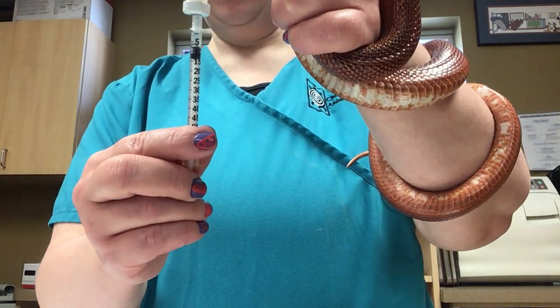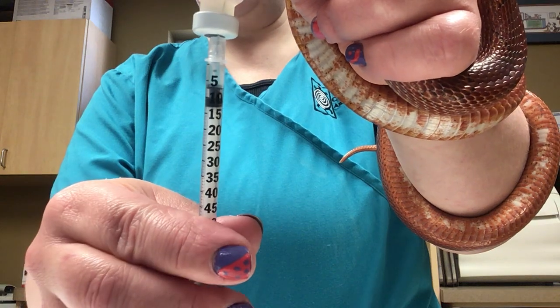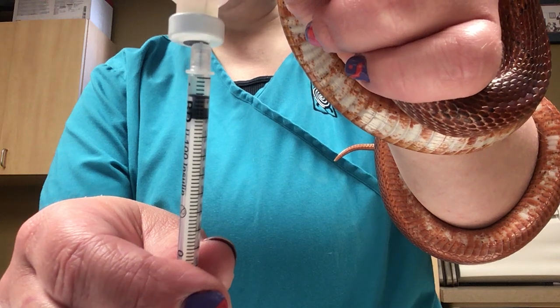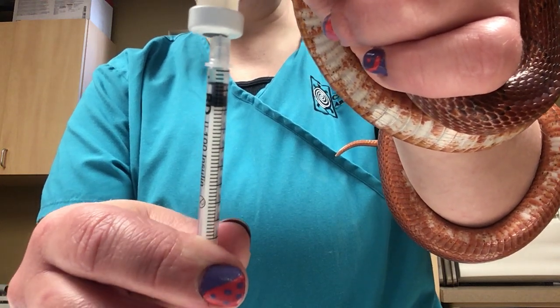Draw back a little extra because you are going to get air bubbles as you can see. You want to flick those up to the top and then push up. Now this particular dose is 0.03, so that will be the marked line — check your instructions, yours might vary.